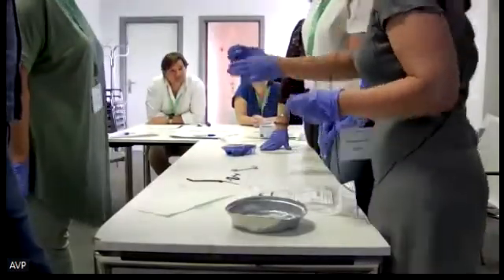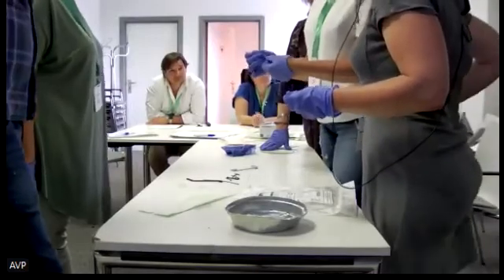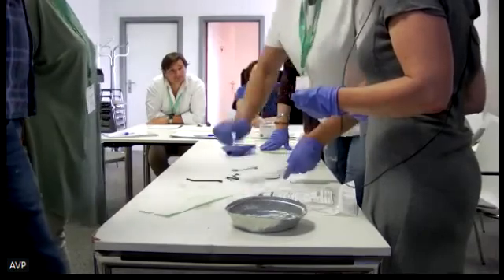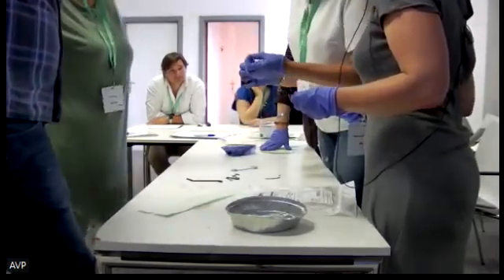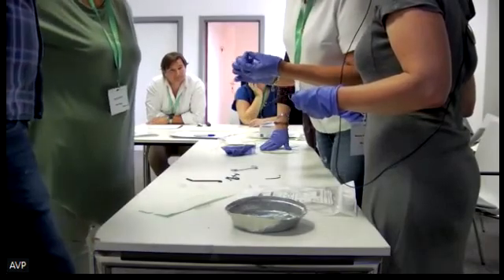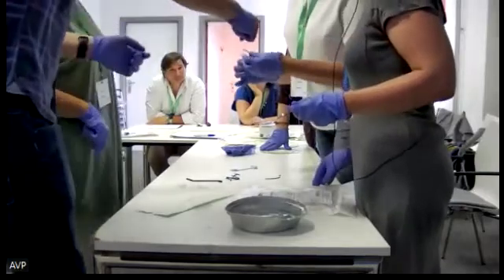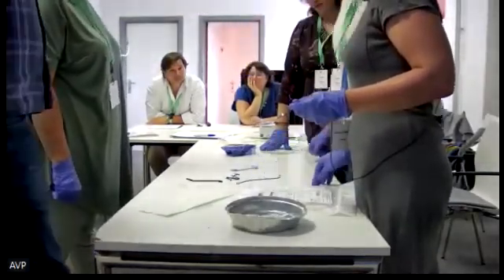And always when you push the stent like that, before you open the flaps, when it's going out of the package, it's like that. And if you put it like that, it's not going to stay inside, because you put it, of course, or you open the. Okay, I get it.